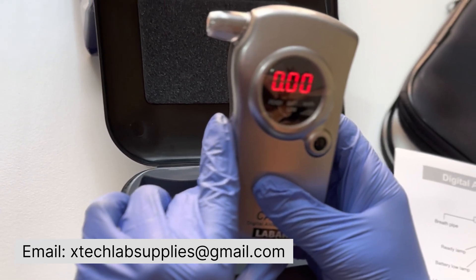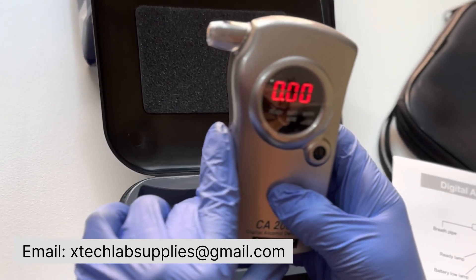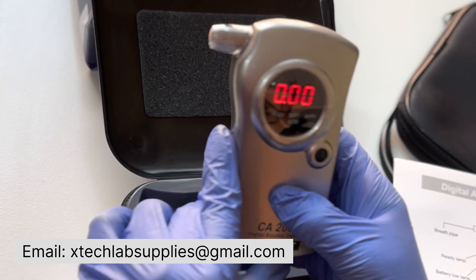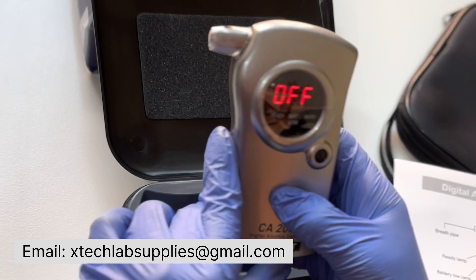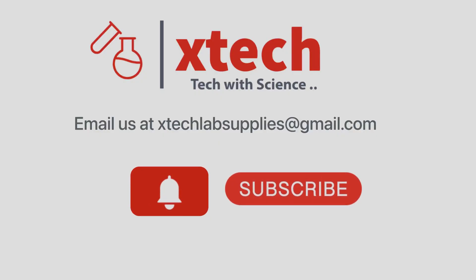The value will be displayed for 15 seconds. It is advisable to have at least a 2-minute gap between readings. The instrument will then finally show off, or turn off.